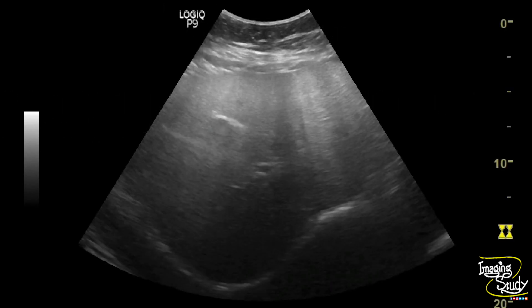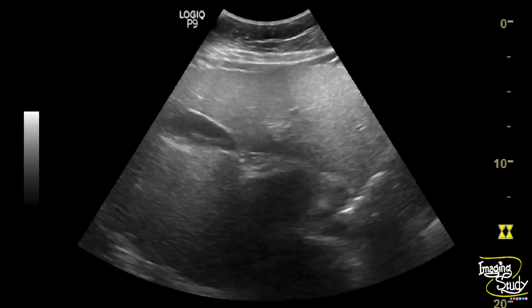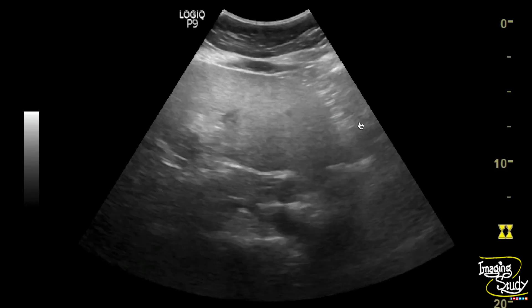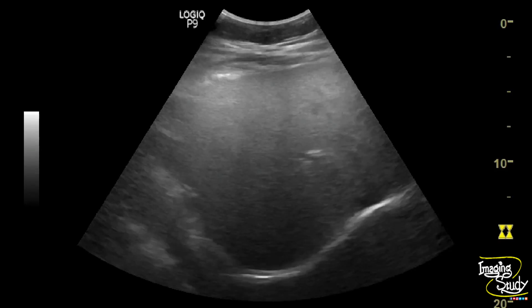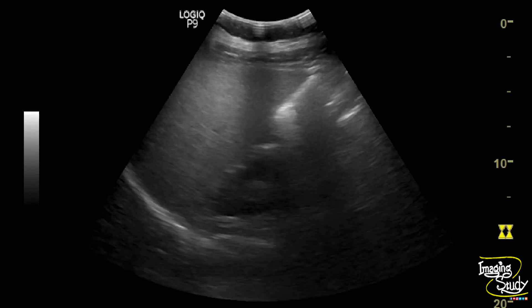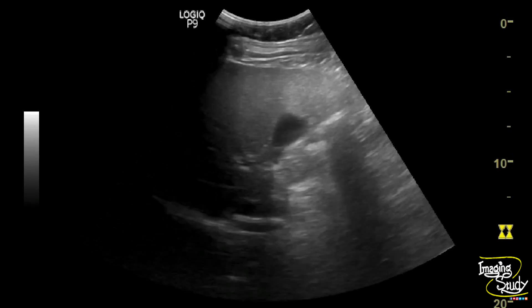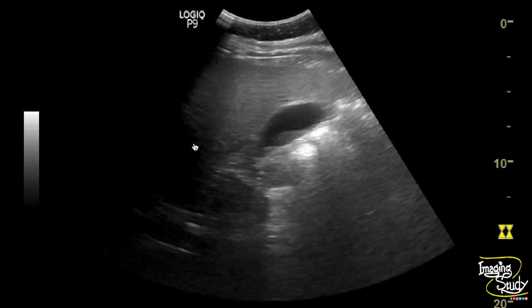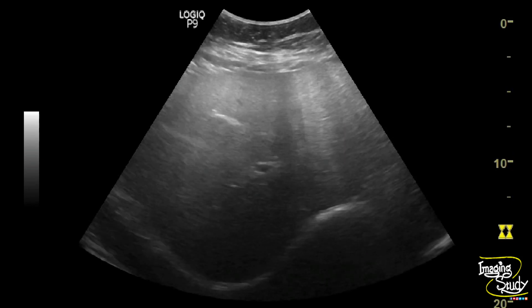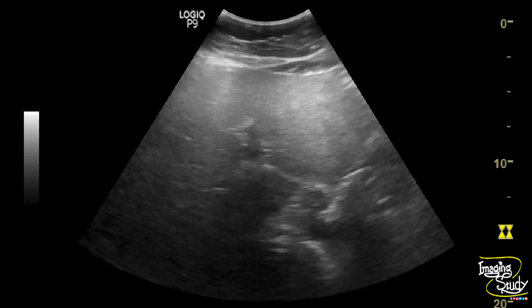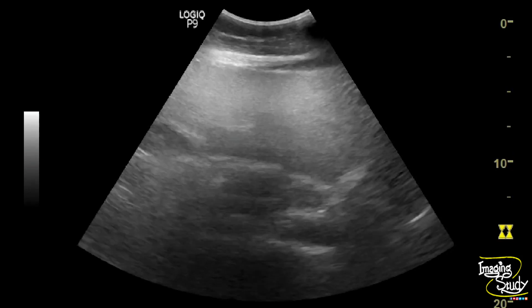An elderly female patient came with non-specific abdominal pain. Let's see what we have got on ultrasound. You can see the hepatic parenchyma — the echogenicity is increased in comparison to the right renal parenchyma. The area nearby to the transducer looks brighter than the distal part, and the intrahepatic vessels and diaphragm are well visualized.